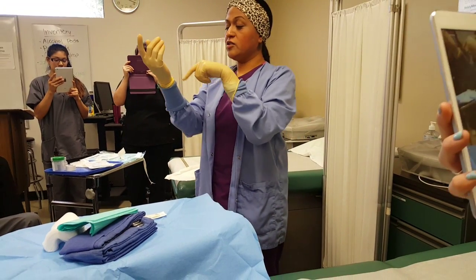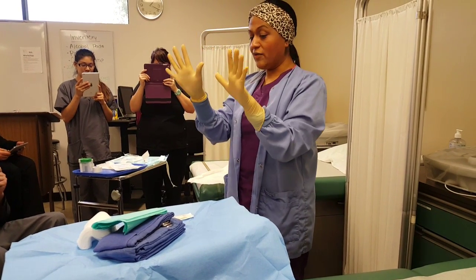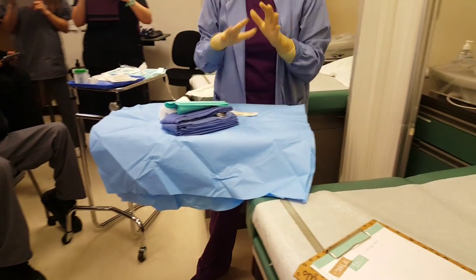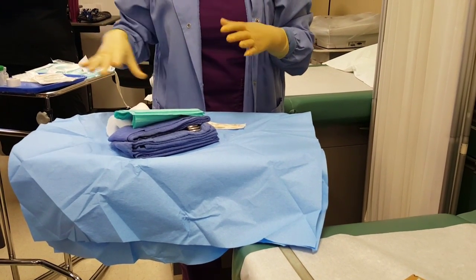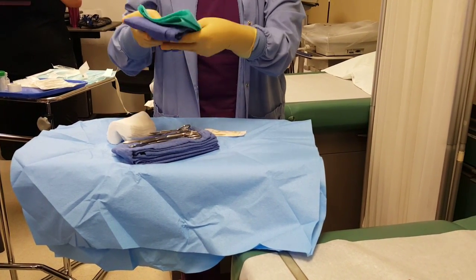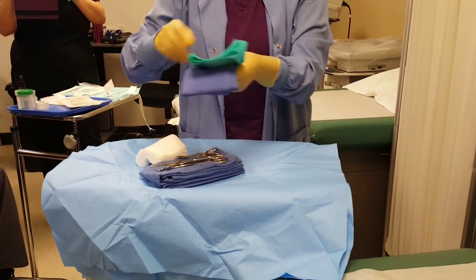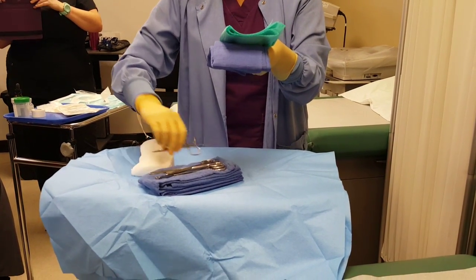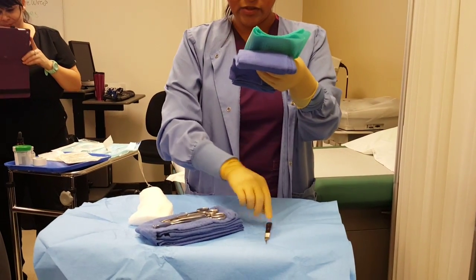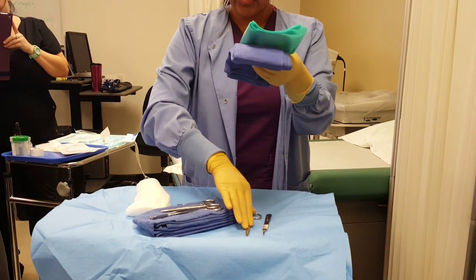You don't want to touch here or here — you can only touch this part of the glove. Now that I have my sterile gloves on, I can touch my items on the tray. I'm going to arrange them the way my doctor likes them. I start with my scalpel because that's what cuts first, then surgical scissors next.